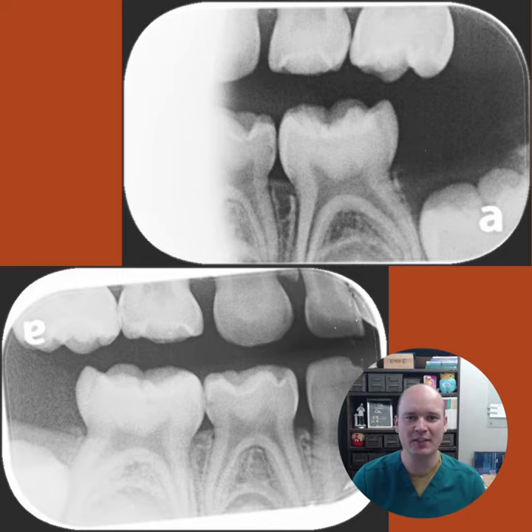Here you can see some small carious lesions on the mandibular primary first molars, L and S. We attempted to treat this young individual with some laughing gas and minimal sedation — that didn't end up working out. We gave the parents the options of going ahead with a Hall crown or SDF. We went ahead with SDF, did two applications, and then put her on a three-month recall to have some social visits to get her comfortable.